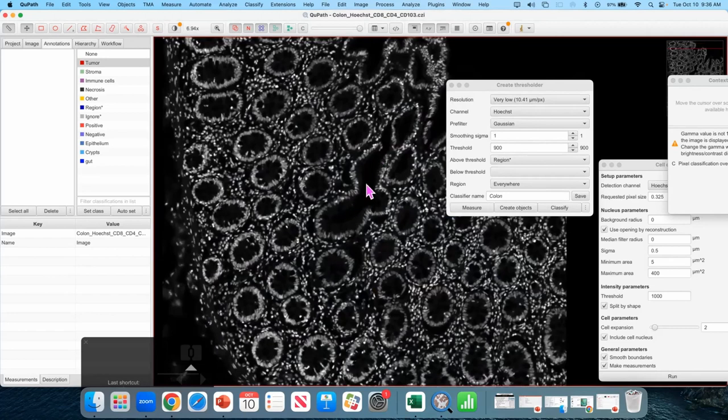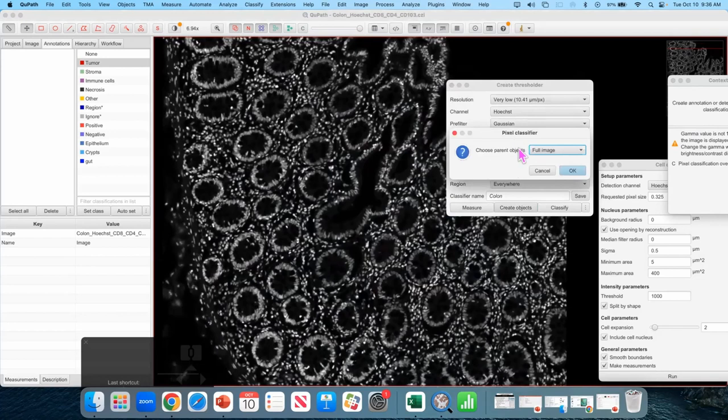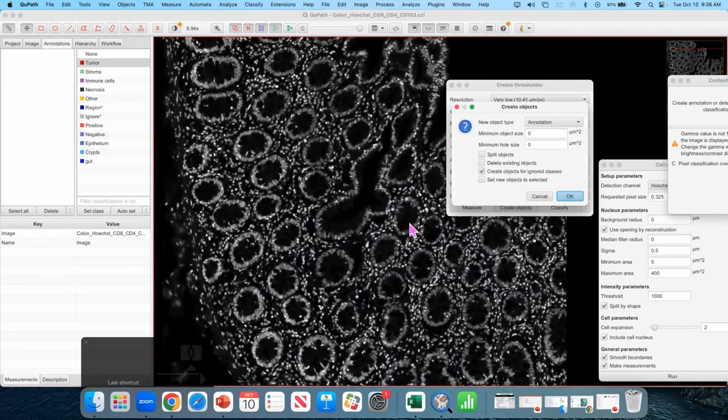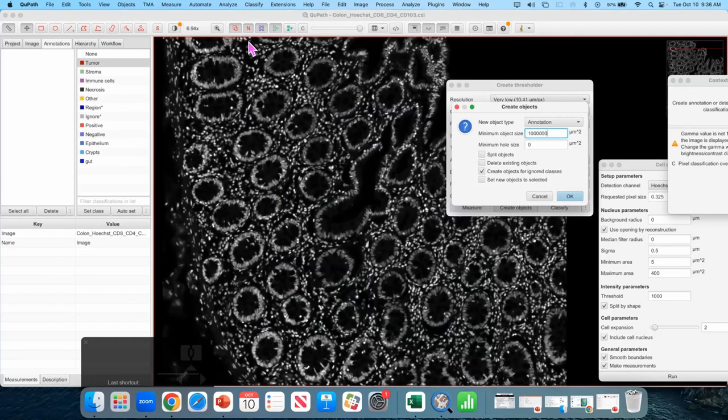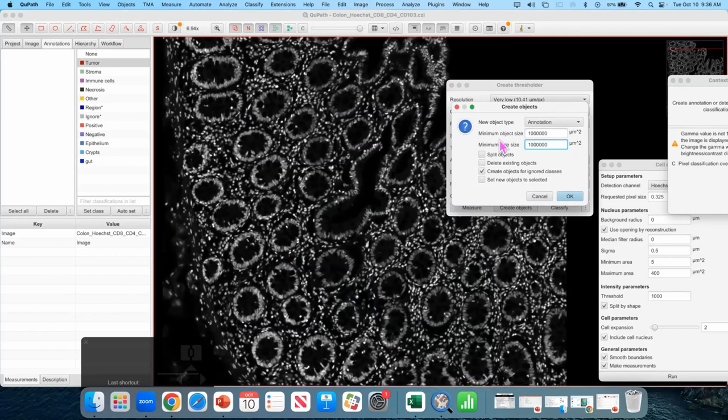It is I definitely want an annotation not a detection because we're going to be working inside of it later. Let's go with a minimum object size of a million. That way things like this little lip here just get deleted because it's too small and I don't care about that flip. The minimum hole size, actually I'm going to cancel this just to show Ken the image. Ken. Would you count this as part of the tissue area? Well are you counting the lumens of the transverse? I am going to have this yes. Because that's just the lumen that's inverted.